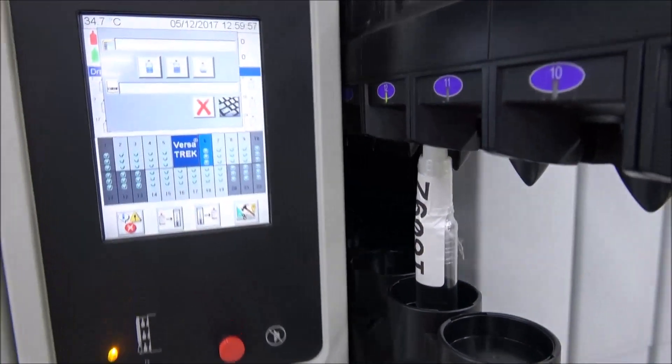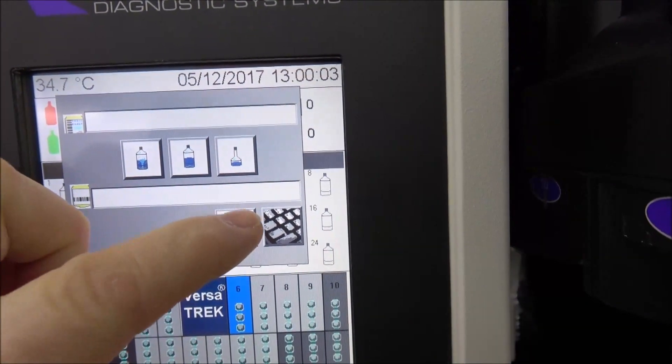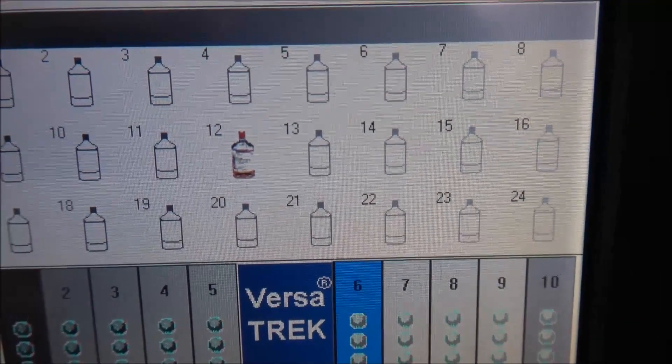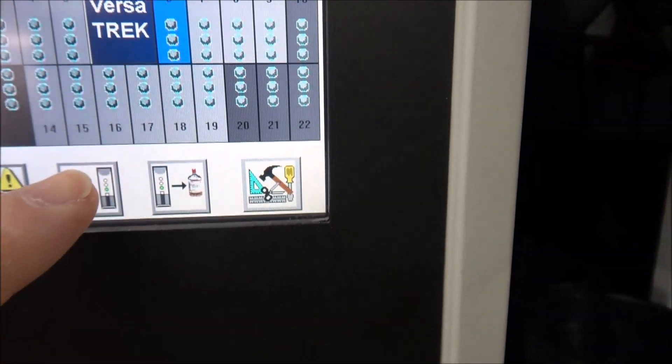You go back over to the screen here. You can see it's ready for another one. Sometimes the touchscreen doesn't want to read my finger. But you can see it did take the bottle — it's red.